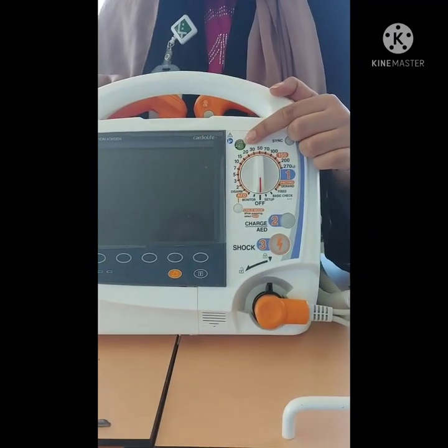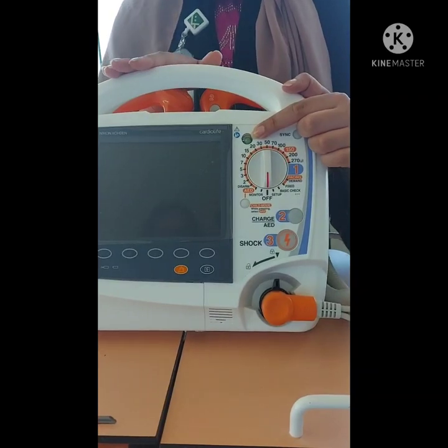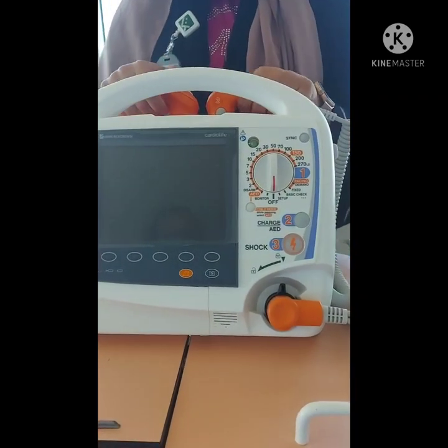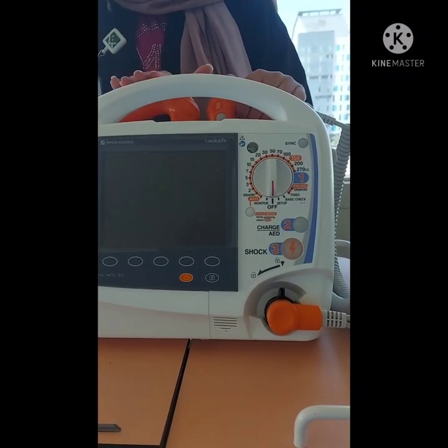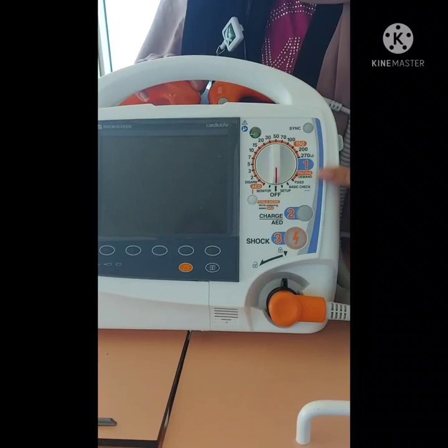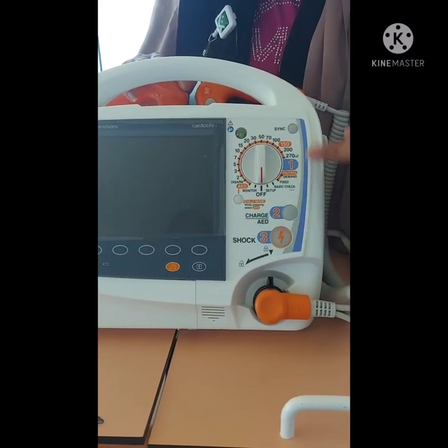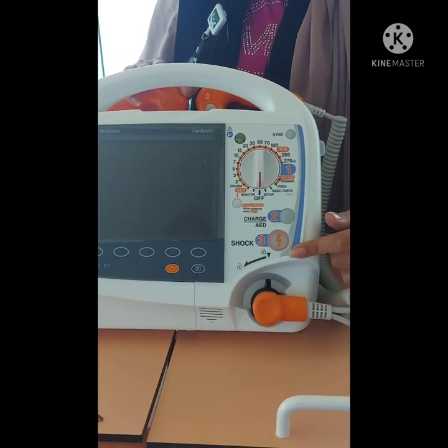Here you have the status indicator. It will be green if the defibrillator is ready to use and everything is fine. It will be red if there is something wrong with the defibrillator and the defibrillator will not work. Okay? Here you can see 1, 2, 3, which is the basic step for choosing the joules, charging and discharging.